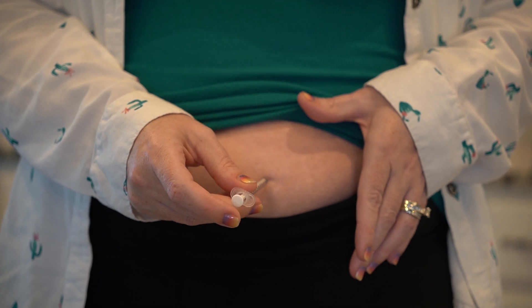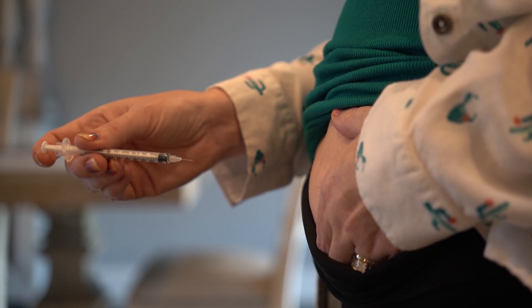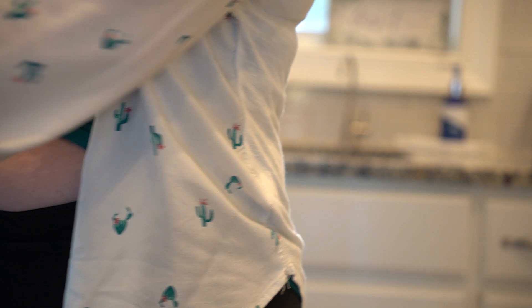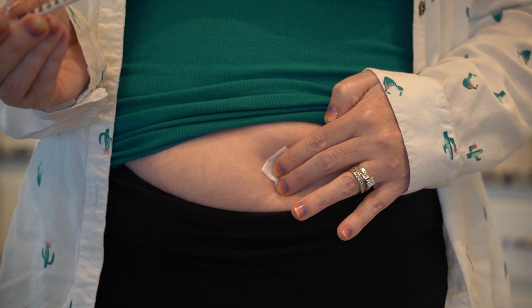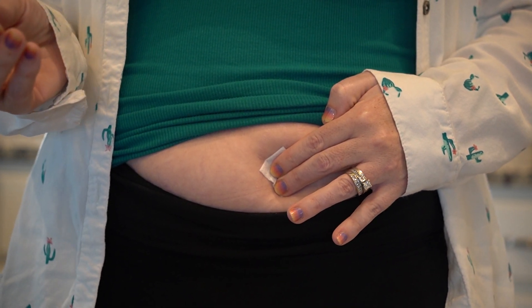After the medication has been administered, remove the needle gently at the same angle it was inserted. Hold an alcohol pad over the site gently. Do not rub the area. Check the area for any bleeding or bruising. Bleeding is not likely, but if there is any bleeding after 15 seconds, cover the area with a band-aid.